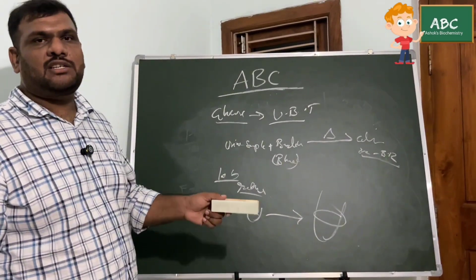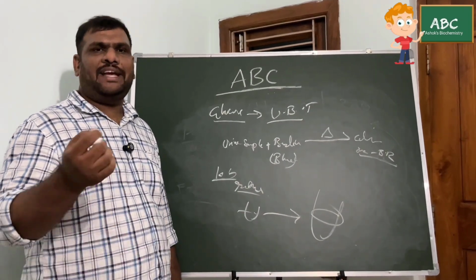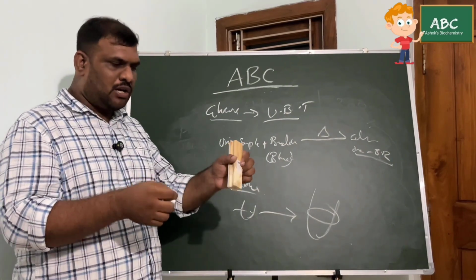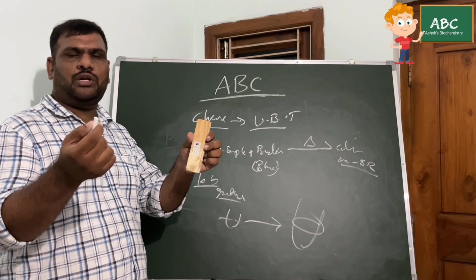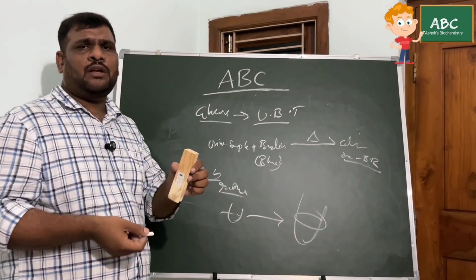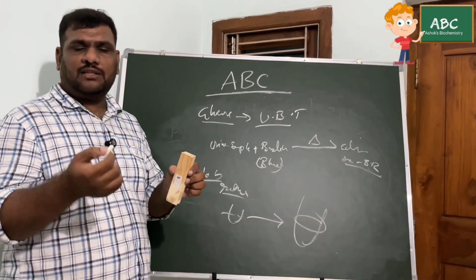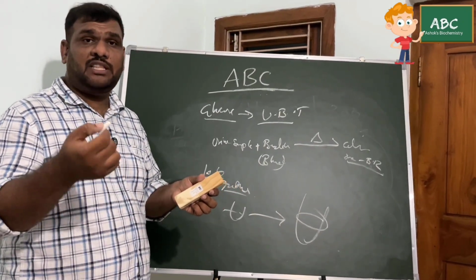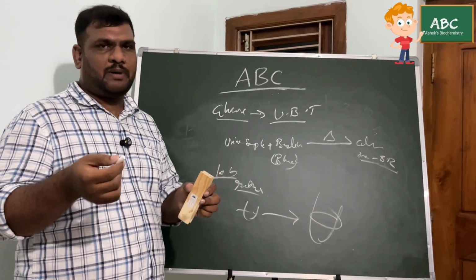When you're doing bile salts and bile pigment, bile salts are very easy to identify. You can do the sulfur test, called Hay's sulfur test. The surface tension is what determines it here. You use a control and a test. In the control, you take distilled water. In the test, you take the sample. In the distilled water, you add one spatula of sulfur powder. It won't sink because of the surface tension. When you add that same sulfur powder to the urine sample with bile salts, it allows the sulfur to sink. That indicates the presence of bile salts in the urine.